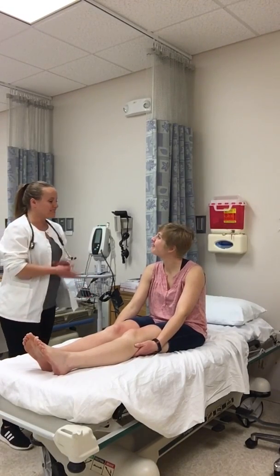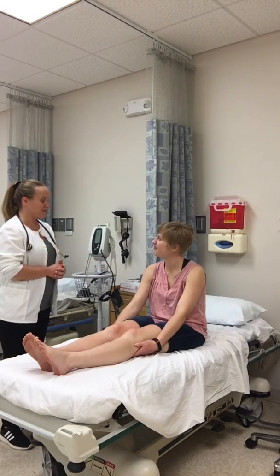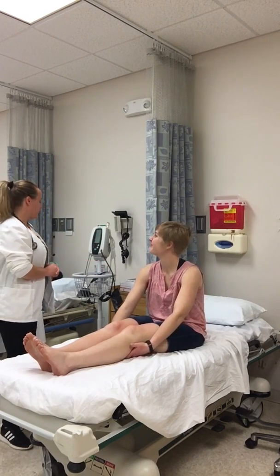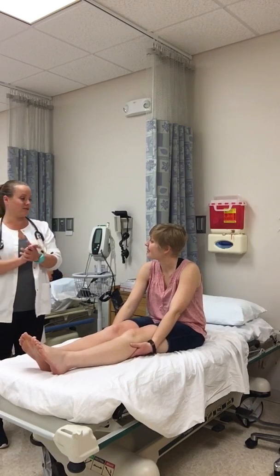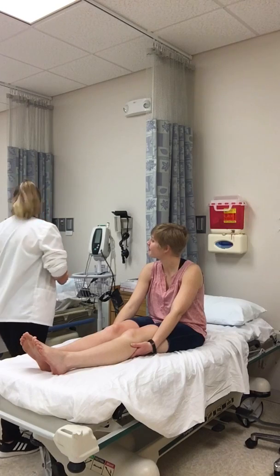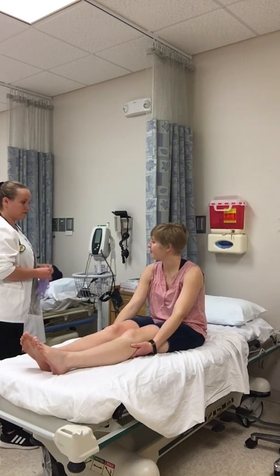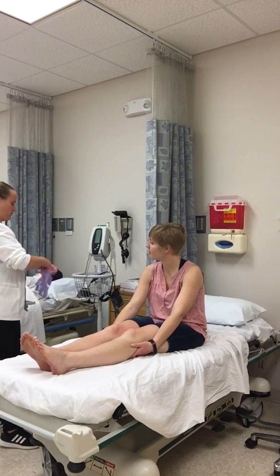Hi, good morning. My name is Lindsay. I'm a nursing student and I'm here to do an assessment on you for my health assessment class. One of the first things I'm going to do is wash my hands for 20 seconds per school protocol. And I'm going to get your vitals — your blood pressure, your pulse, your temp, your respiration rate.